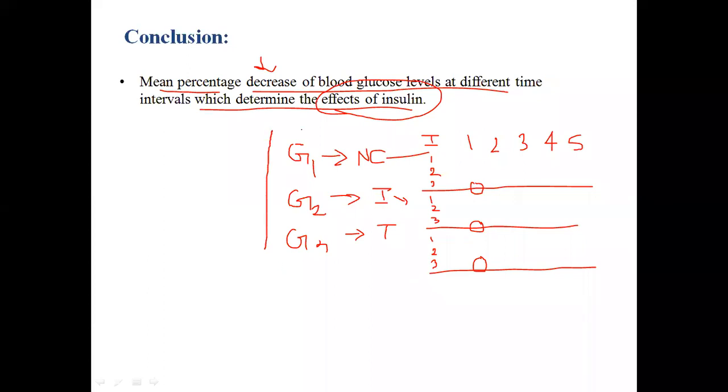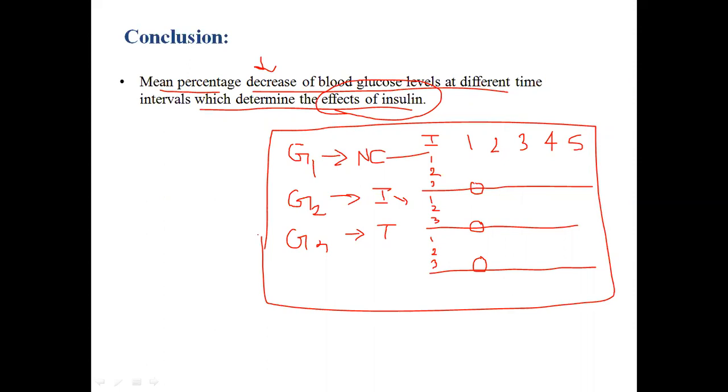So this is a research protocol. Okay, so this is your experiment.